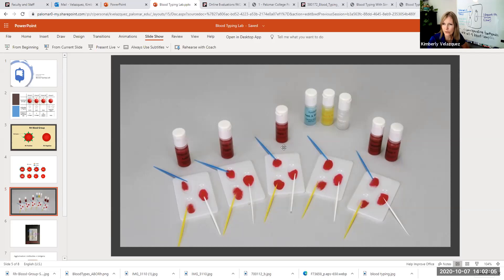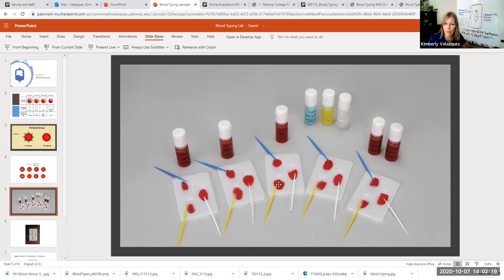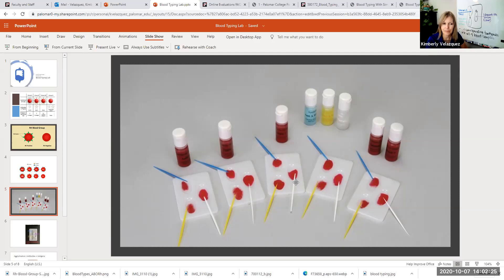You also want to make sure that you use the corresponding colors of toothpicks. So the anti-A serum is blue. You will use a blue toothpick in the A well. The anti-B serum is yellow. You will use the yellow toothpick in the type B well. And then finally, the RH factor is white or clear, and you will use the white toothpick for that.